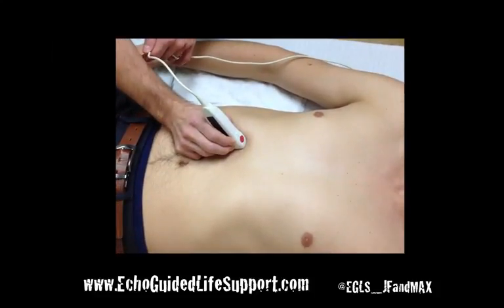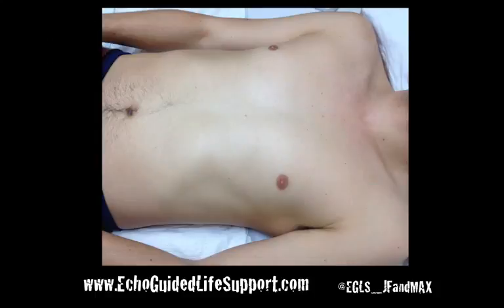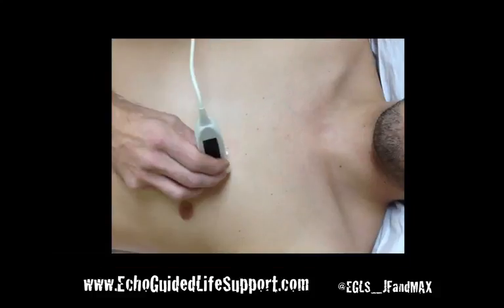If the patient isn't clearly hypovolemic or distributive, we'll have to assess heart function. We'll start by doing the parasternal long axis view by placing the probe around the 3rd intercostal space near the sternum, orienting the probe marker towards the patient's right shoulder. By putting the probe on the thorax, if we don't immediately see the heart or can't find it, we will do what's called chest surfing.